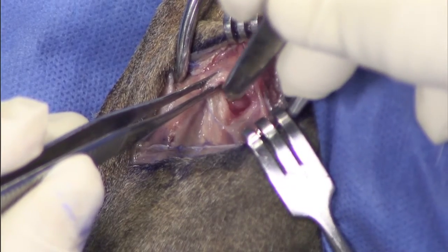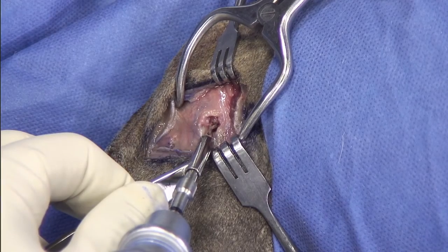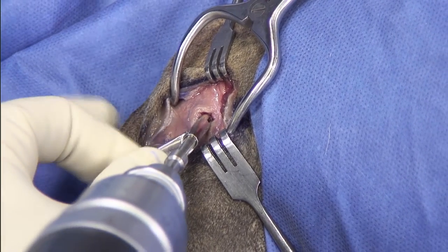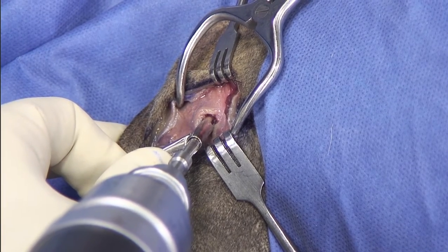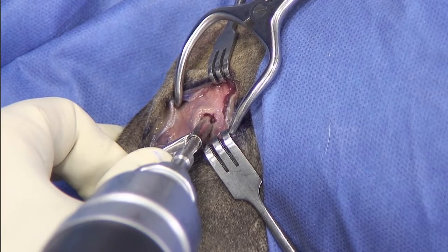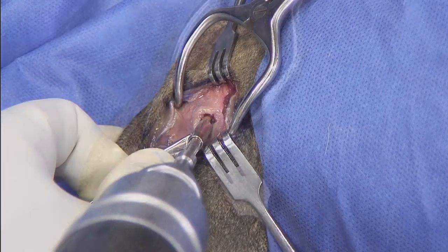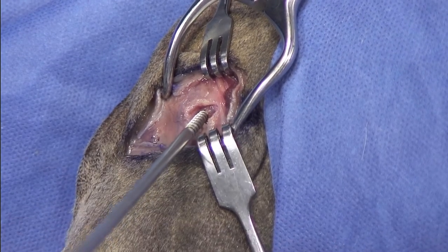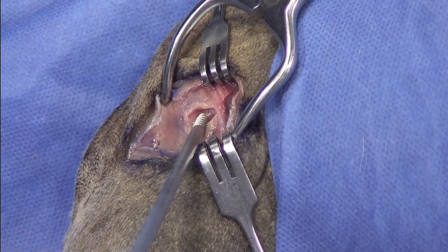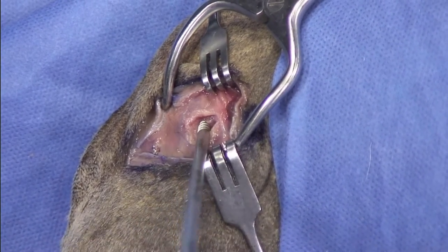For me the ideal entry point is right here. One option is to pre-drill with a K-wire, but I think I can just go ahead with this drill bit. As you can see, I'm directing the tunnel a little bit proximal and cranial. We're going to tap the hole with a 3.5 swivel lock tap, which is important because it will facilitate inserting the swivel lock.